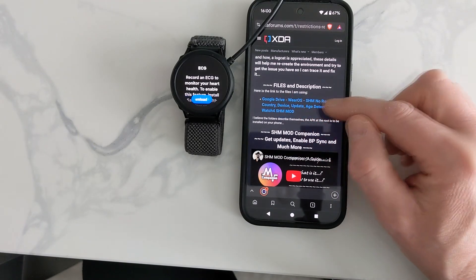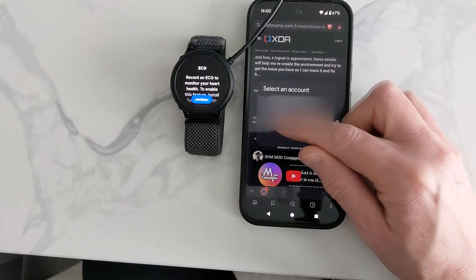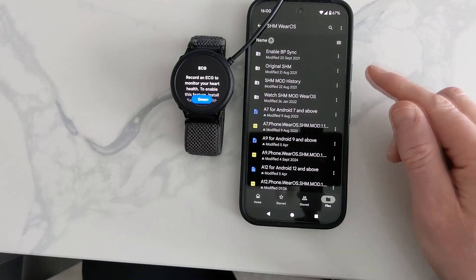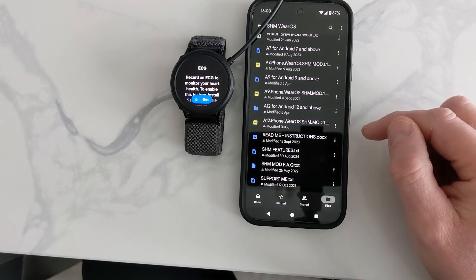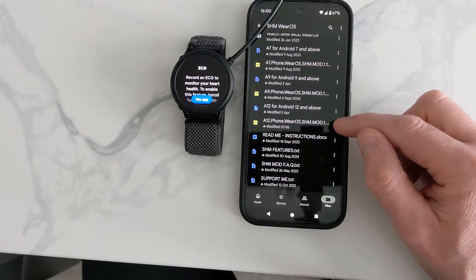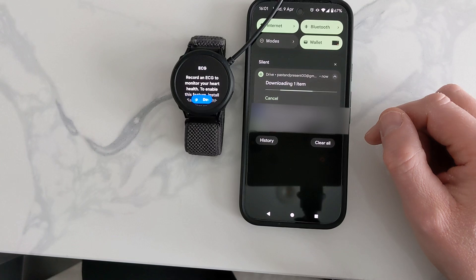That was the app we downloaded earlier, but now we're going a bit further up the page — it uses Google Drive again so you have to choose your Google account. Here are all the apps listed. This is a brand new one and it's an A12, so we need the A12 APK file. Click on the three-dot button and go to download.